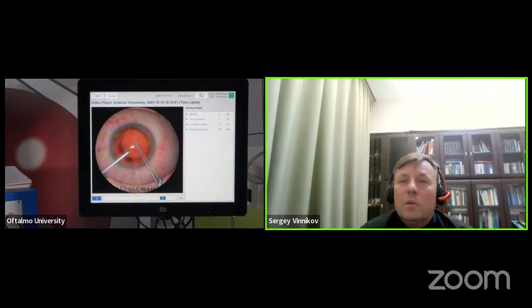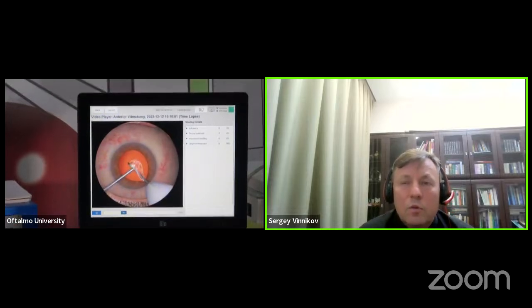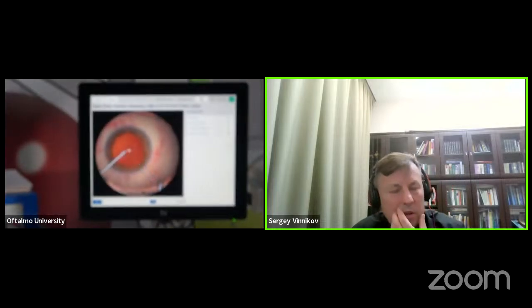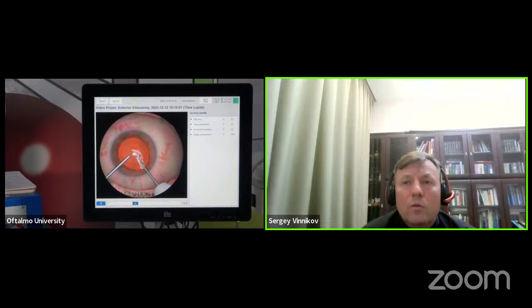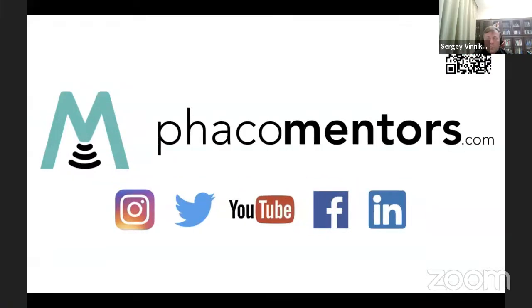Очень продвинутая система, то есть позволяет не только дать качественную оценку этапам, но и все это объективно выражено в виде цифр: сколько процентов стекловидного тела осталось в передней камере, сколько не выстрижено и так далее. И плюс фиксация действий, например неправильных, которые можно потом посмотреть в записи, что было сделано неправильно.